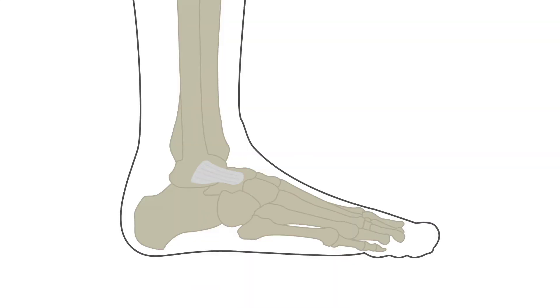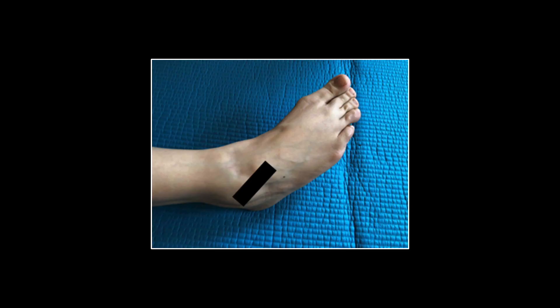We'll begin by looking at the anterior talofibular ligament, which is situated between the fibula or lateral malleolus and talus bones of the foot. The foot should be positioned in plantar flexion and inversion, as this adds a slight stretch to the ligament for optimal scanning.